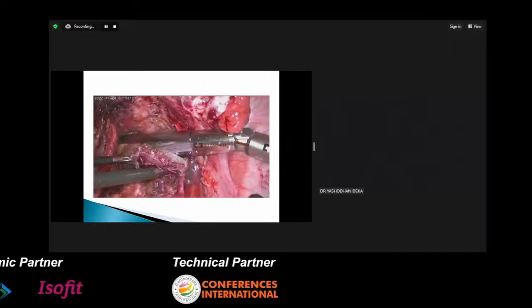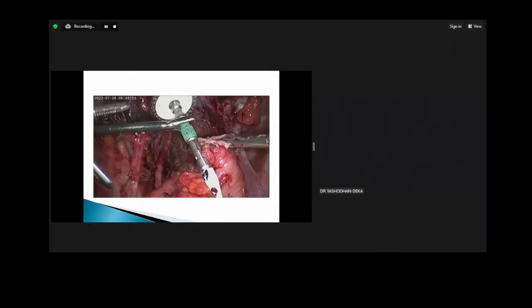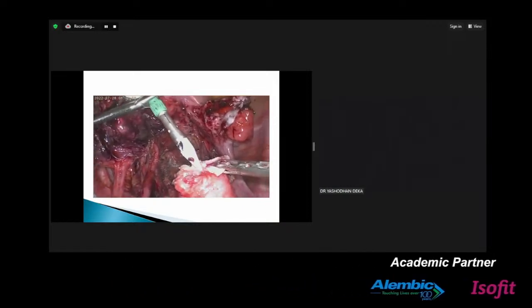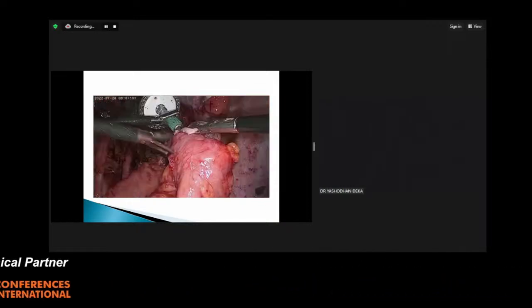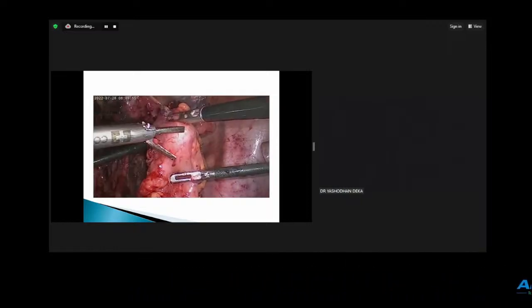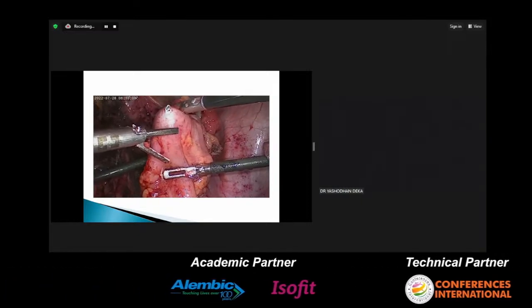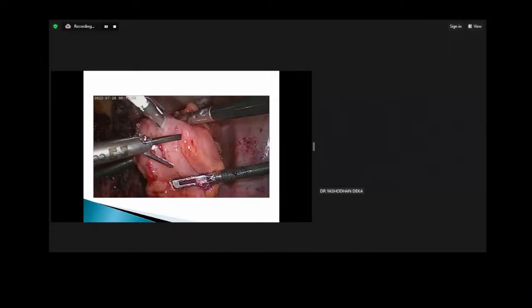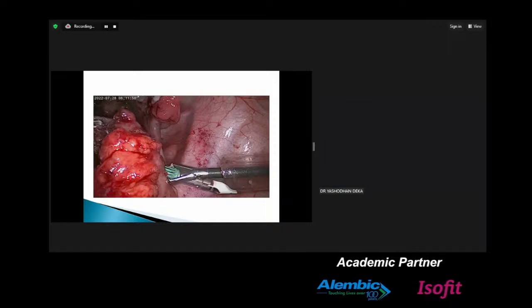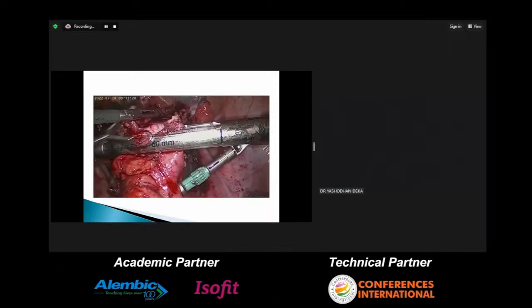It's very challenging at times because the space in the pelvis is very narrow. Then you introduce the anvil into the proximal segment. Once you introduce it to the proximal segment, make sure the assistant is holding the bowel stable. Make a small nick by an ultrasonic scalpel or a monopolar, whatever you're comfortable with. You introduce the anvil into the proximal part, and then you close it by a linear stapler. So this is an end to side.